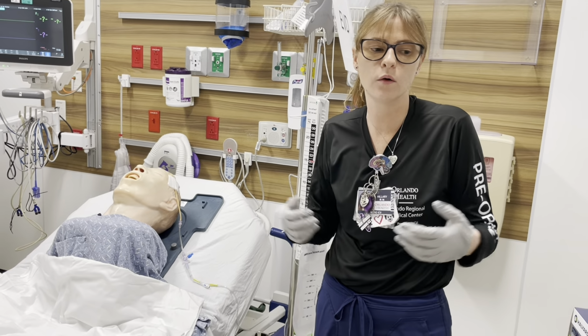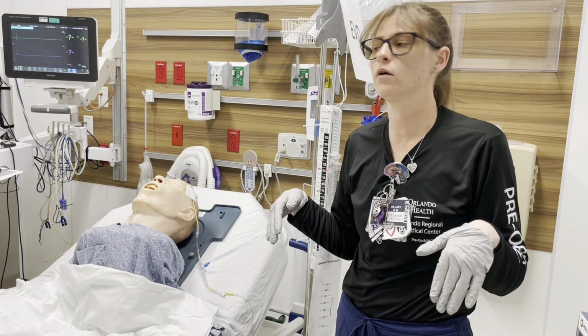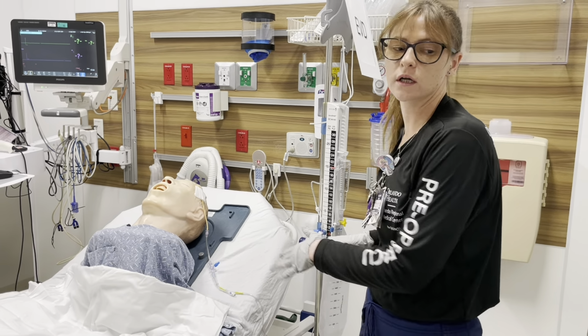At this point, we can start getting sterile. We are going to be opening things. We don't necessarily need to put on sterile gloves just yet, but it's a good idea if you're going to be getting ready to go ahead and get your cap on, get your mask on, get your patient's mask on, get your gown on, so that way your patient isn't coughing on what you're doing over here, and so that way everybody's staying all nice and clean. So we'll go ahead and do that now.